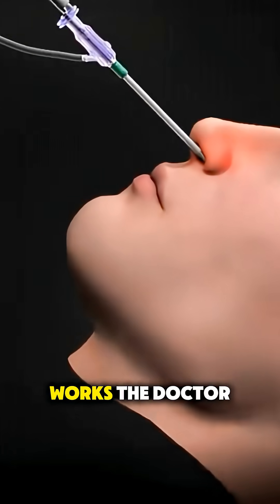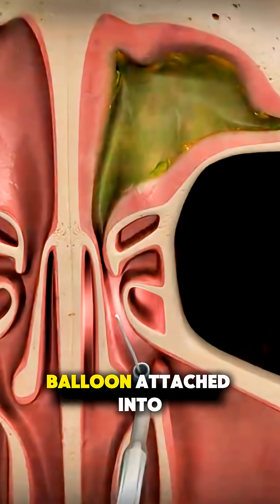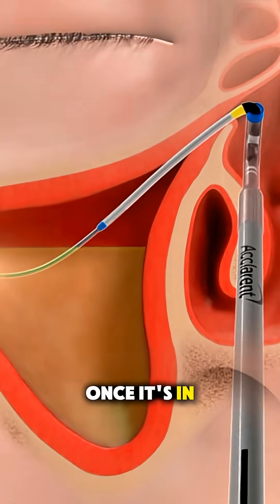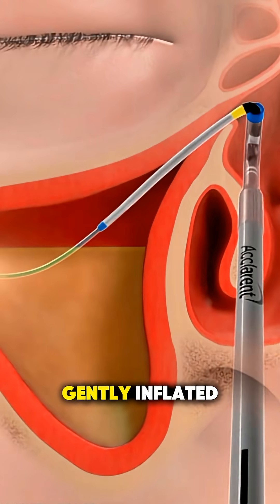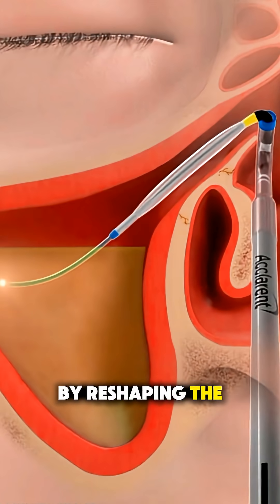Here's how it works. The doctor inserts a thin, flexible tube with a small balloon attached into your nostril and guides it to the blocked sinus opening. Once it's in the right spot, the balloon is gently inflated, which widens the sinus passage by reshaping the surrounding bone.